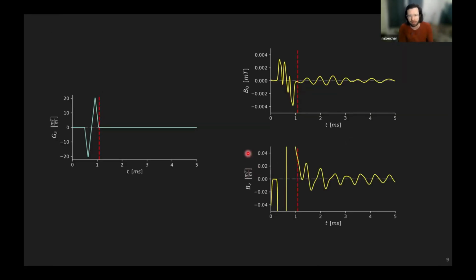Okay, so this is some of our first field camera measurement work. It's a really simple experiment, just using the Skope camera and playing a bipolar. I put the trigger here. This line is not the trigger. We trigger somewhere over here and measure the whole waveform. This red line is just for reference in these two images to see where the bipolar ends.